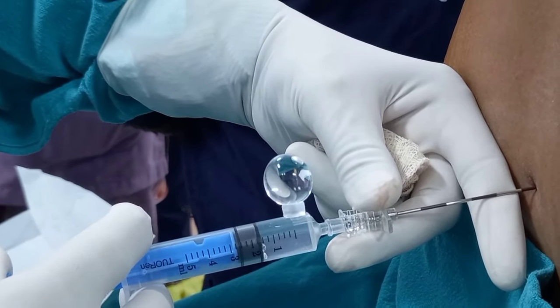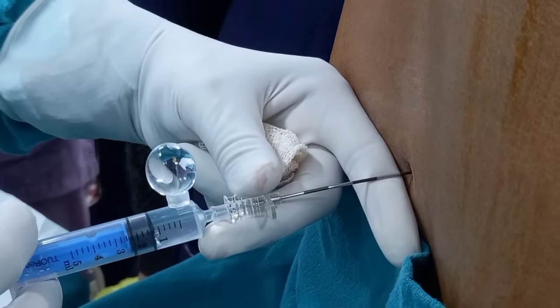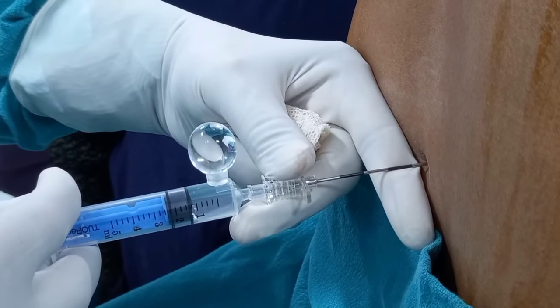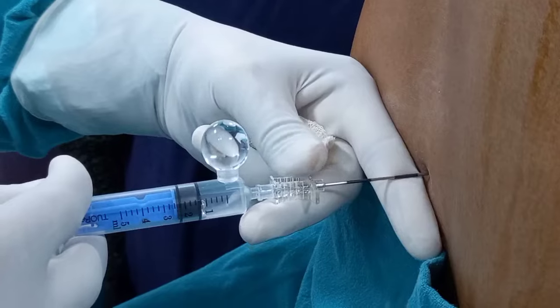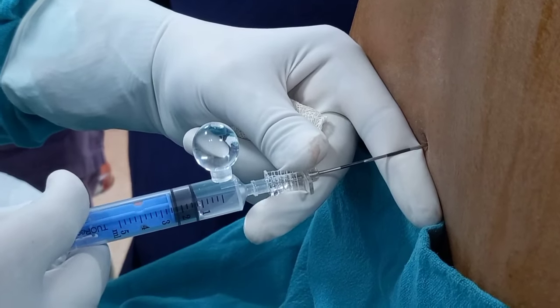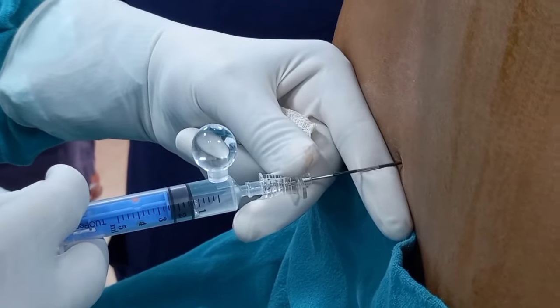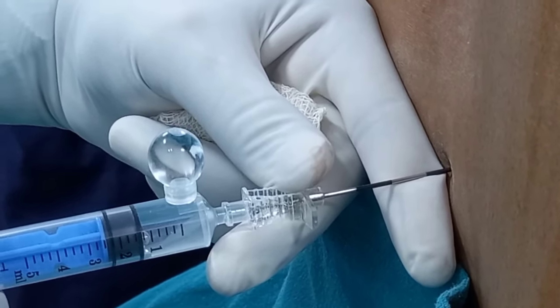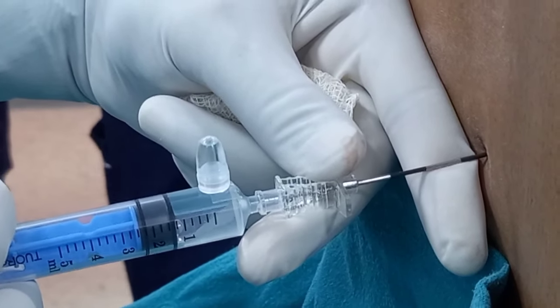Now the syringe is pressed gently to pierce the ligamentum flavum gently — not to be forced. There is some obstruction, so changing the direction towards the cephalad. Once the epidural needle crosses the ligamentum flavum, this balloon should deflate. So gently. Now the balloon is deflated. This means the needle is in the epidural space.